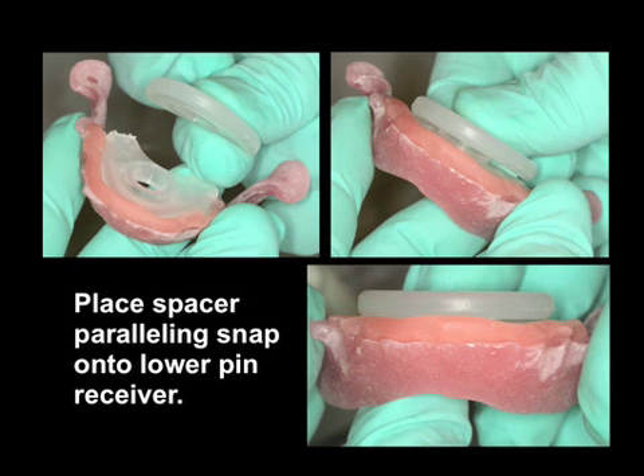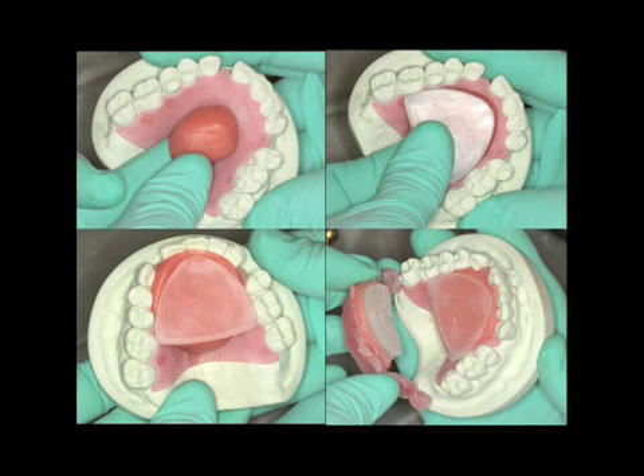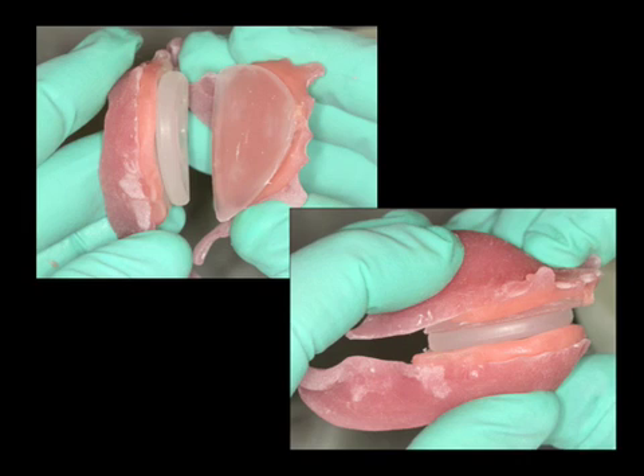It is now necessary to place the spacer. This is a paralleling spacer which will snap onto the lower pin receiver. This will assist in mounting the maxillary striking plate. Both plates will be mounted to become parallel with each other, and the paralleling spacer will also give additional room for the pin to work. Once accomplished, we will put light resin on the upper palatal resin, place the striking plate, and then take the lower paralleling snap and place it into position against the upper. This will ensure the parallelism of the upper and lower devices.